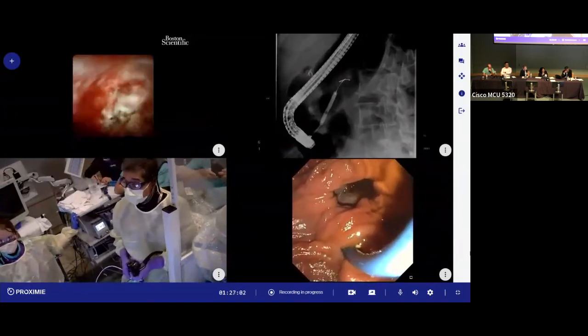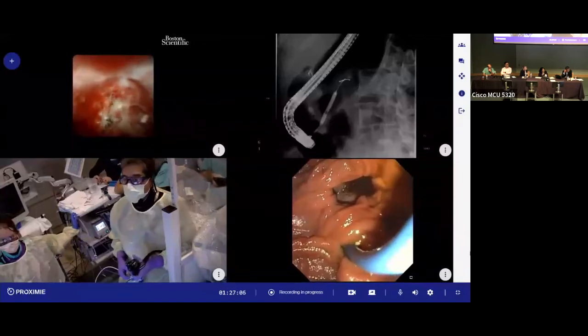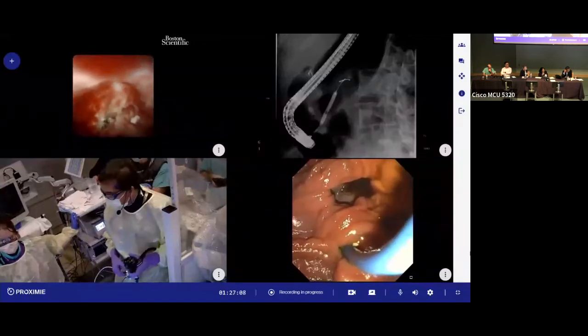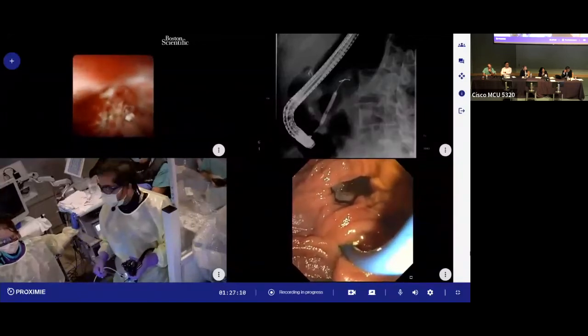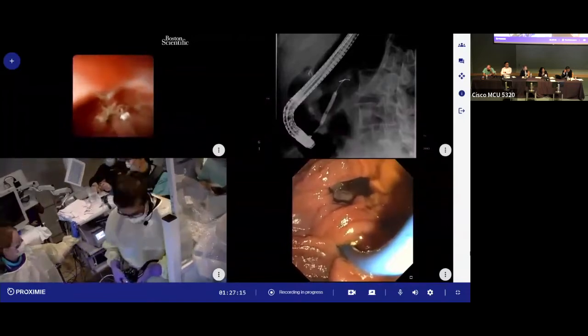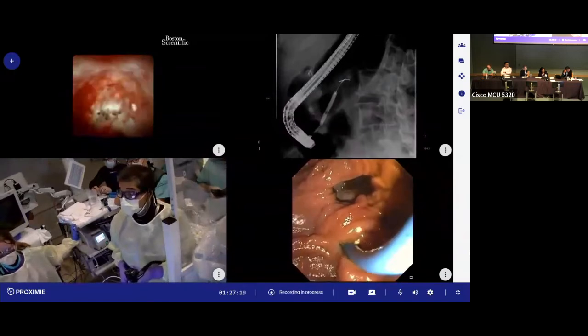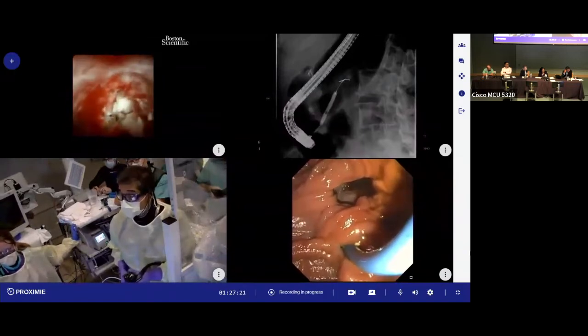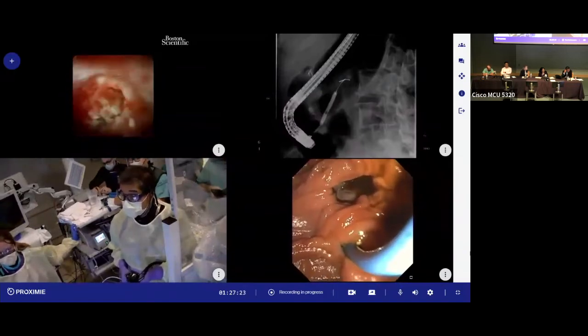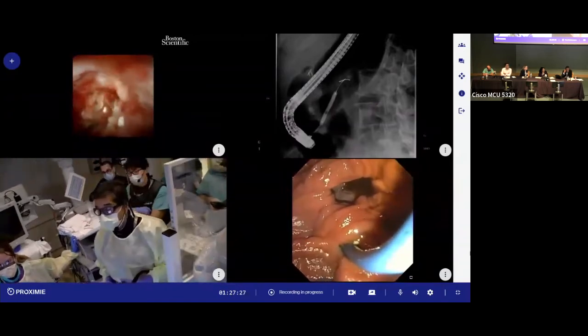Our urology colleagues probably use higher settings when they're ablating. Miranda's back here from the laser company. I have Christy here, Tronic, and Michael somewhere around me. Dr. Hahn is behind me. He doesn't like being behind me during procedures anymore because his training is completely done, but he gracefully agreed to stay behind me for this case.